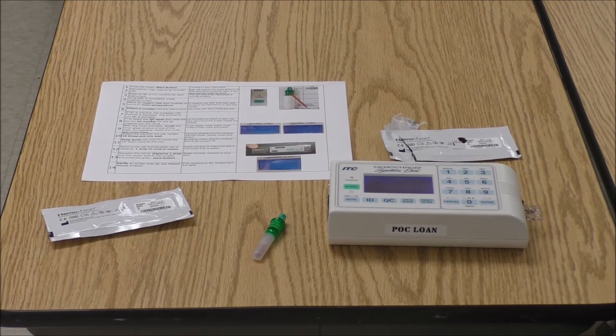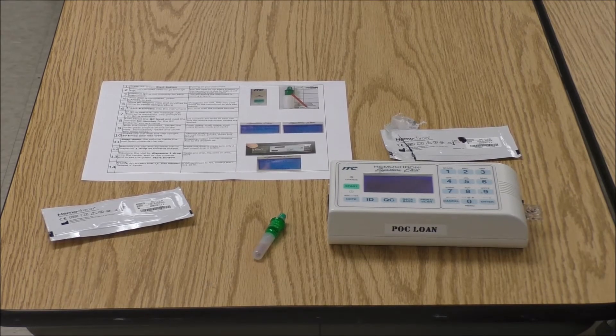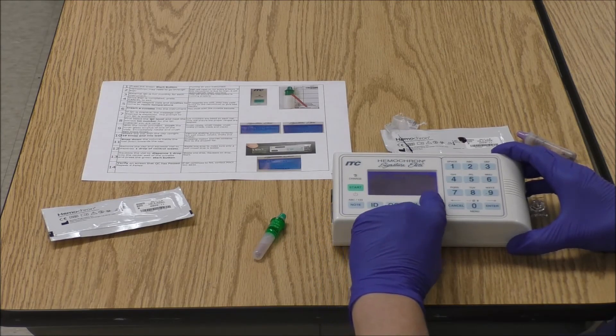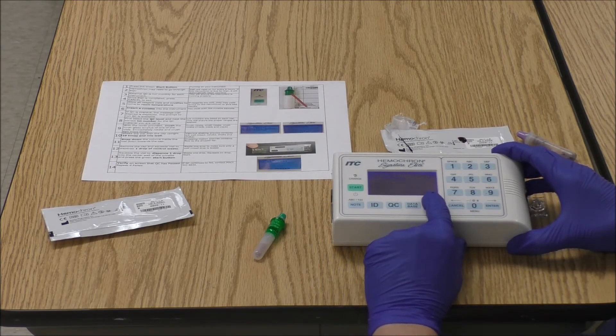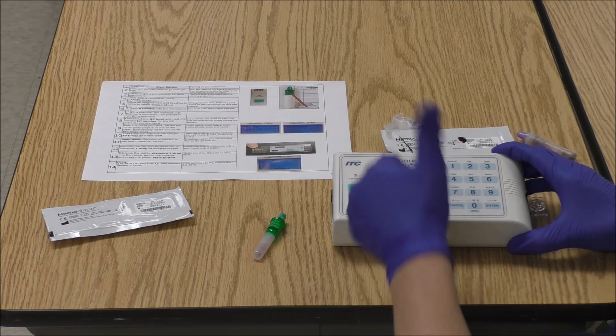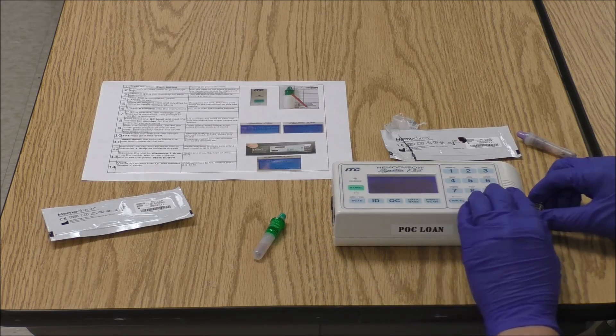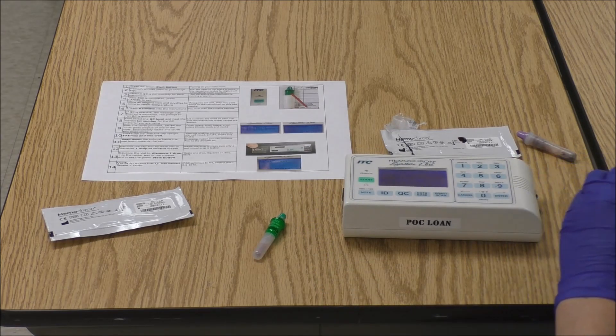The Hemocron Signature Elite is now running your QC. When QC is completed, it will give a beep, and at the bottom it will say 'Test completed.' Remove the cuvette, and you should see the words 'QC passed.' If it says 'QC failed,' you need to repeat that level of QC again. Pull out the cuvette and throw away your supplies.